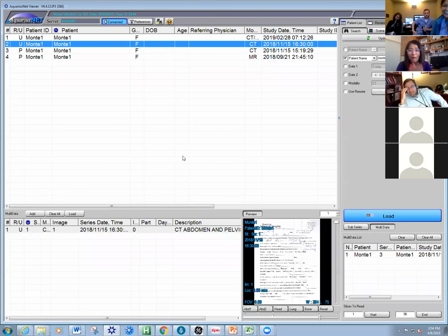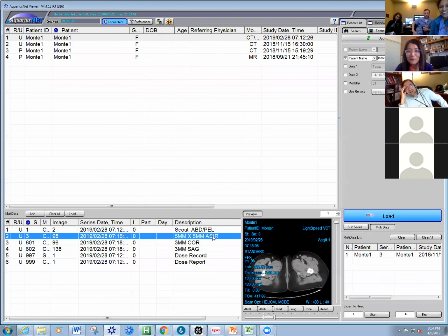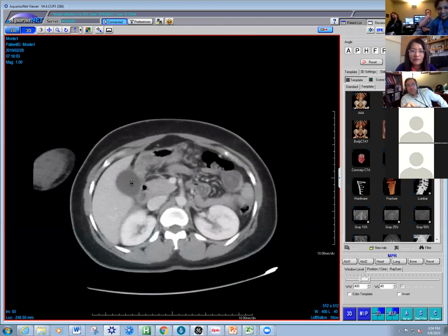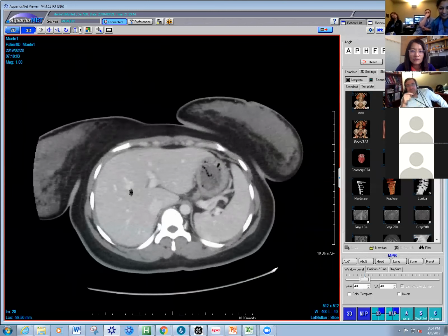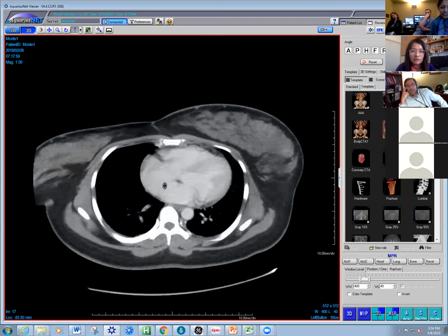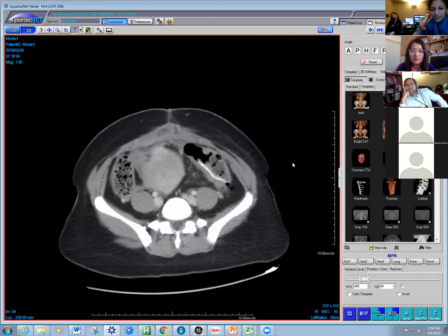The sad part is that towels and sponges have a metallic marker on them. They're not supposed to use towels and sponges that don't have radiopaque markers. Right. I have to say we do have a pretty large population who comes from outside. That capsule around it makes me think that maybe it's also in a bag.